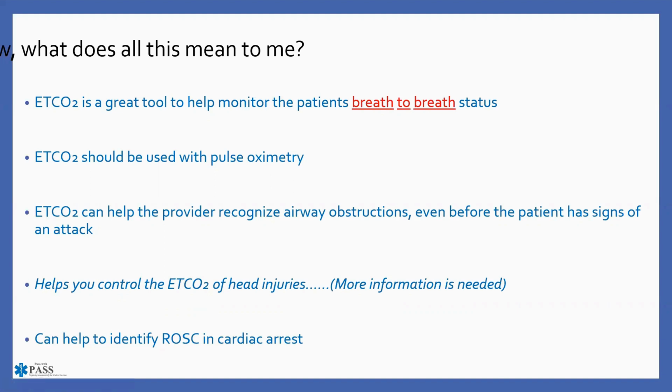More information is needed, and that goes back to the studies that have been done, as we looked at 2009 and 2019. I think the evidence is more favorable now that we maintain that level around 35 or so, and now they're actually adding in some hypertonic saline, like 3% saline, etc. And then it can help you identify ROSC in cardiac arrest patients.